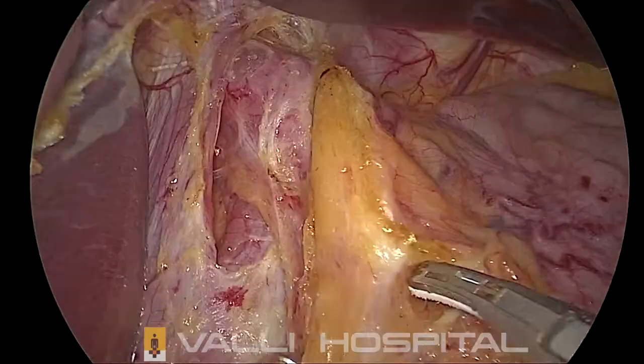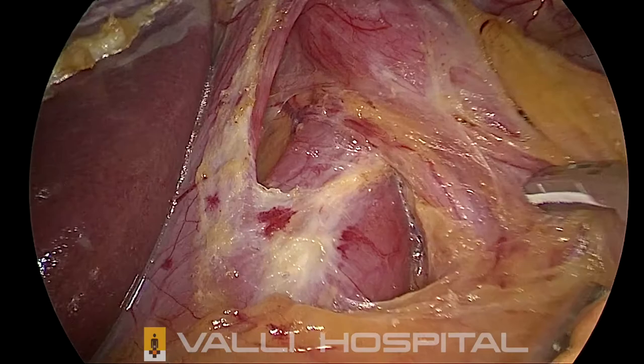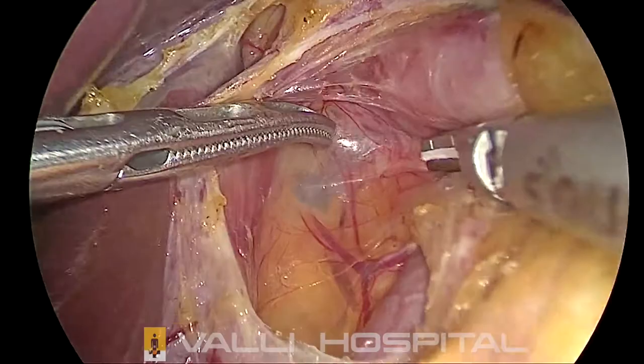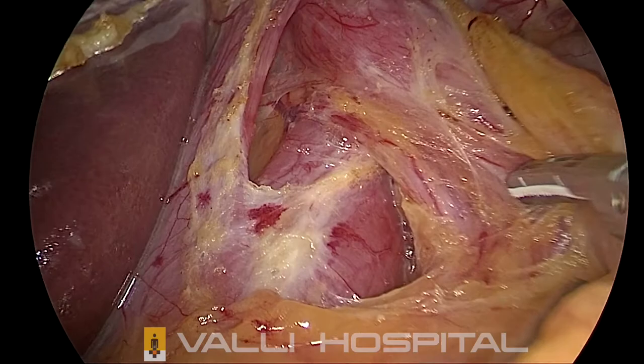You have to identify the posterior vagus as early as possible and safeguard this. See, you can see the posterior vagus, a vessel running over the posterior vagus. Just lift the posterior vagus along with the esophagus. Now I am descending a little bit inside the mediastinum. All this mediastinal dissection can be done later. Now lift the vagus along with the esophagus. Don't separate the vagus from the esophagus. That's very, very important.